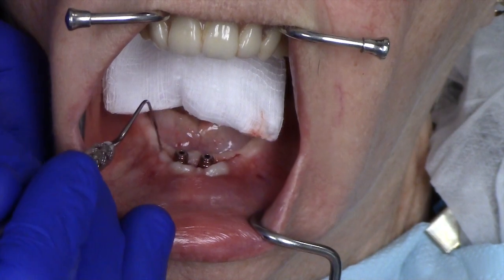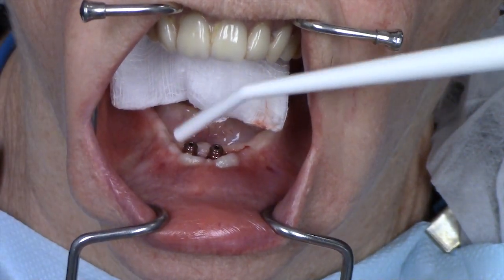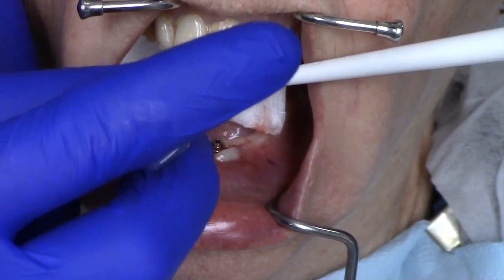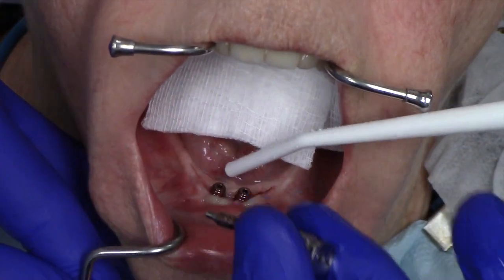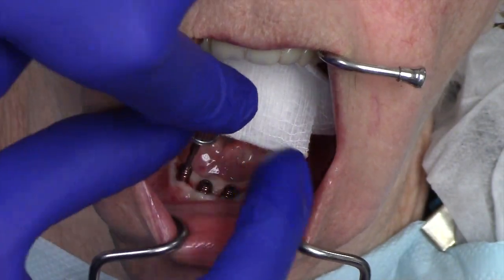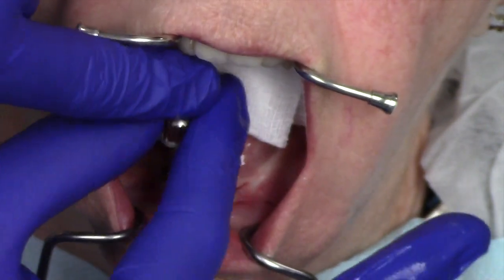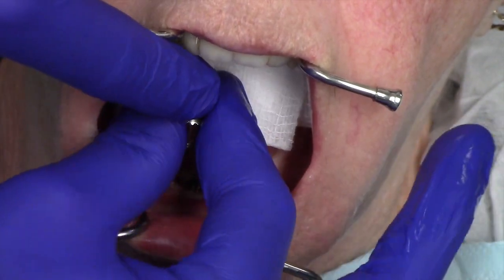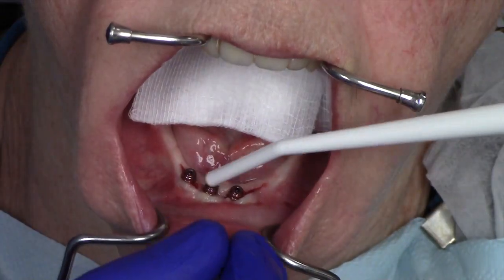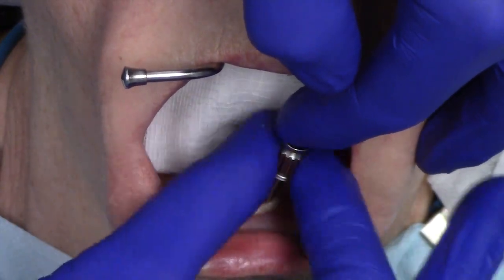The implant tissue height is measured using a periodontal instrument contacting the top of the implant and measuring the height to the top of the soft tissue. For example, if I measured a three millimeter tissue height, I place a three millimeter locator RTX abutment. Chlorhexidine irrigation was applied and the locator RTX abutment was placed using the same 0.050 inch hex driver. Notice how snug my fingers get when I tighten the abutment down. Be careful here because I'm using a platform switched implant and soft tissue has not fallen over the top platform of the implant.